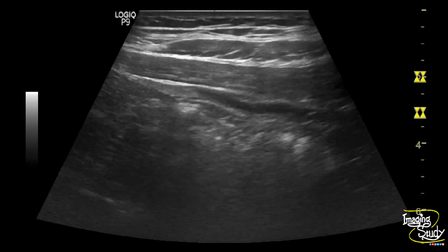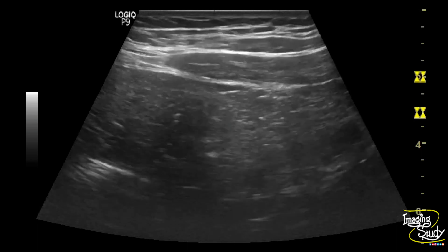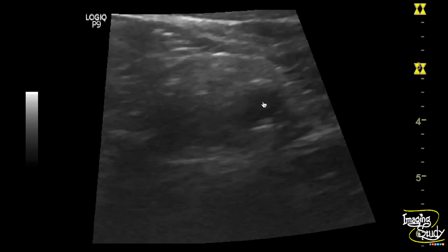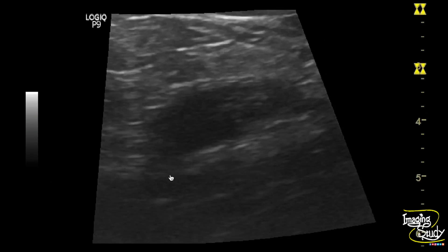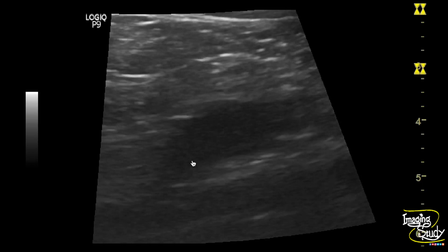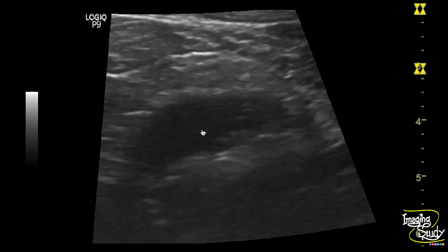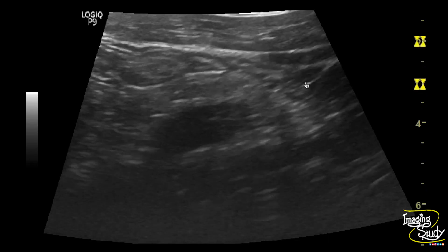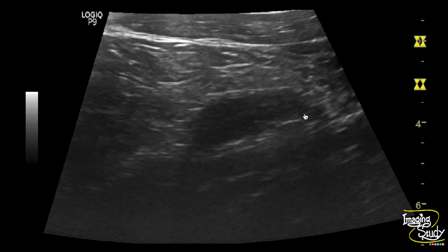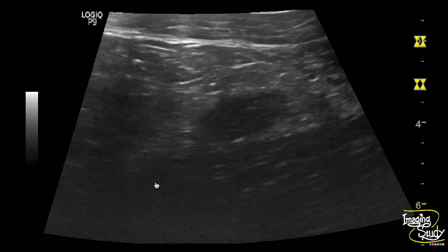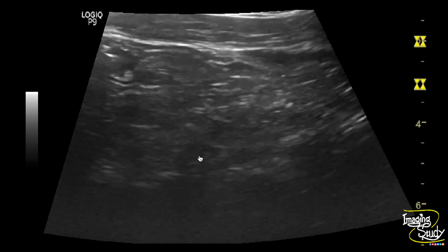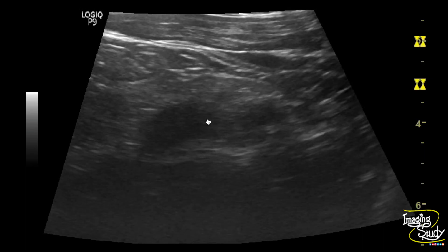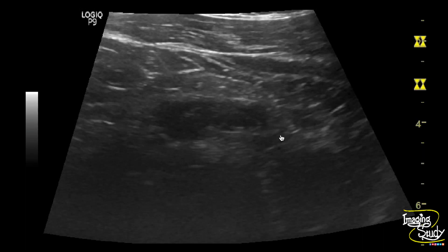Here you can see the high frequency linear transducer view of the right iliac fossa. You can see a blind-ended tubular non-compressible structure with surrounding hyperechoic covering. One end of this structure is connected to the adjacent cecum, indicating it is of intestinal origin.